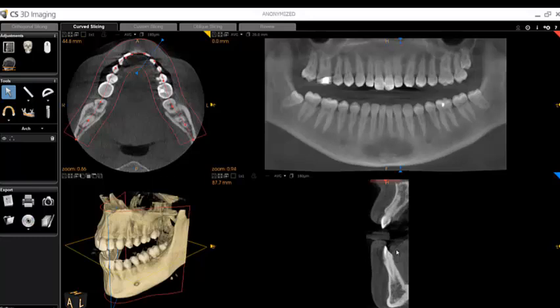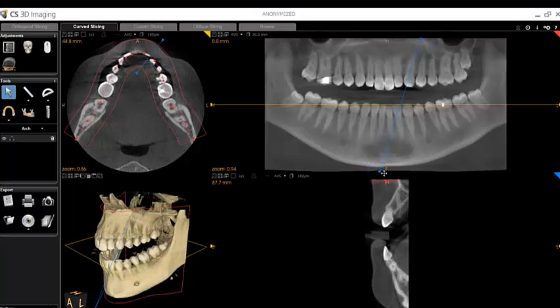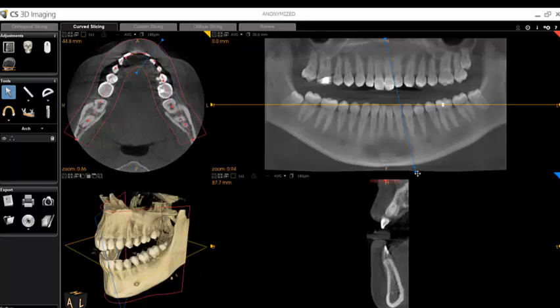It's important to note that there is also a smaller blue ball on the blue movement handle. By default, the cross-sectional view in the lower right-hand corner is a true vertical cross-section along the long axis of the blue movement line in the panoramic image. Depending on what region you're viewing, you may not always want a true vertical cross-section. The smaller blue ball allows you to left-click, hold, and adjust the angulation of the long axis, as it will affect the accuracy of your measurements.